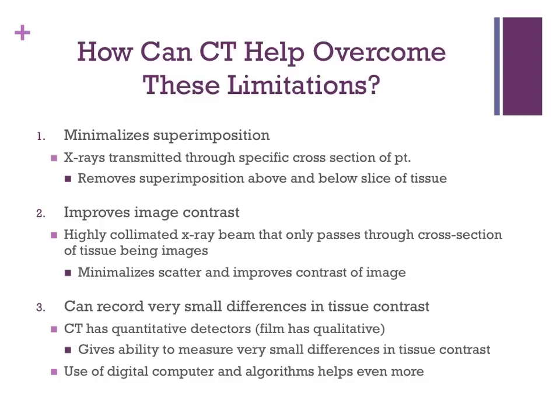The beam of X-rays is highly collimated into a very narrow beam that only passes through the cross-section of tissue to be imaged. And this procedure minimizes scatter radiation and also improves the contrast of the image.